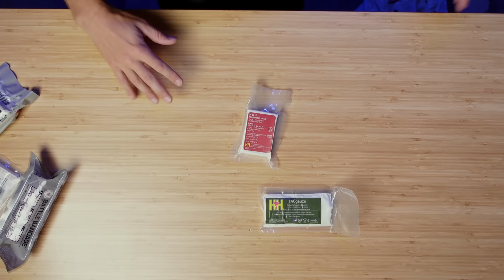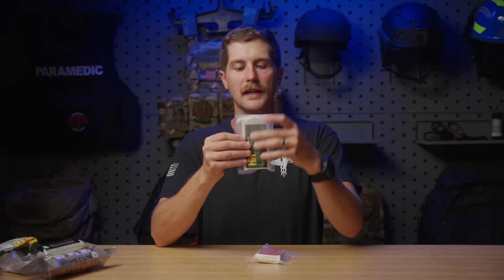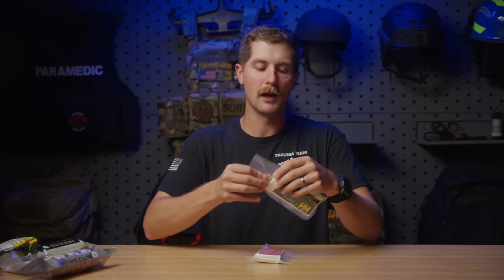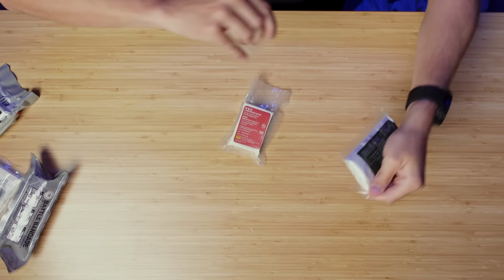All right, moving on to the two H&H products. H&H makes a great product. One of my favorite things is this TACgauze because it's really thin. It fits in a lot of different kits very easily. Sorry, I didn't talk about that one. This one does not have markings on the serrations to open, but still pretty obvious.